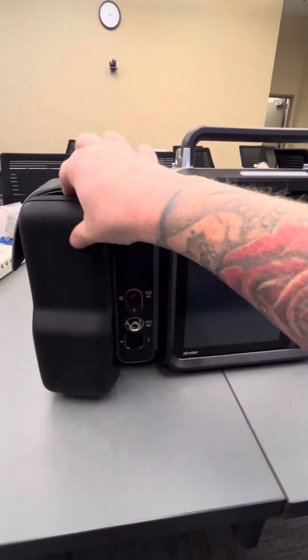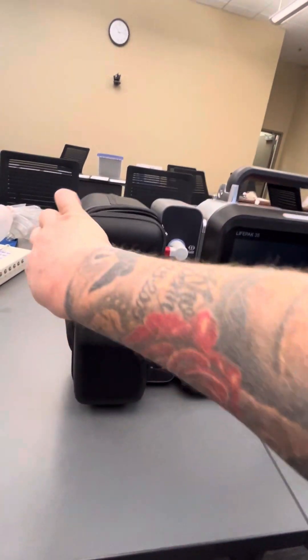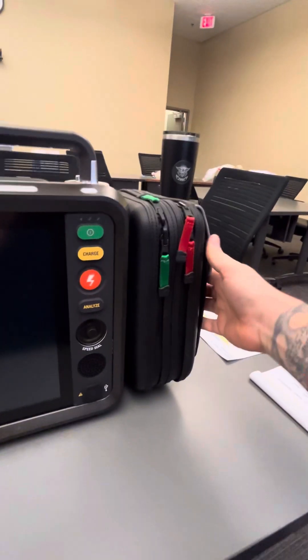You'll notice the top closure is a zipper and the bottom is a magnet — that's a new feature they have added. There is also a pouch on the left that contains the bariatric cuff.